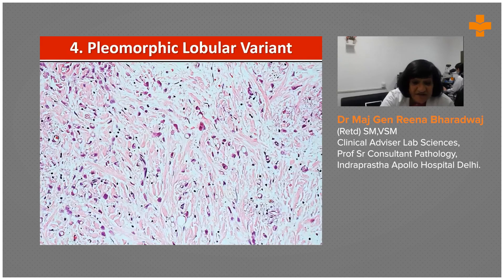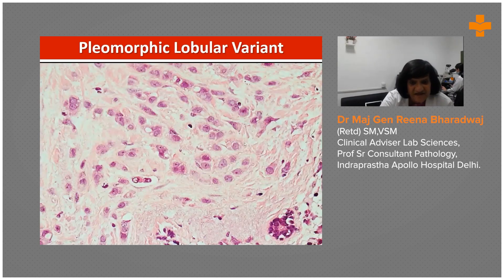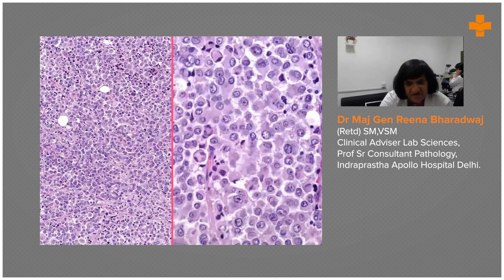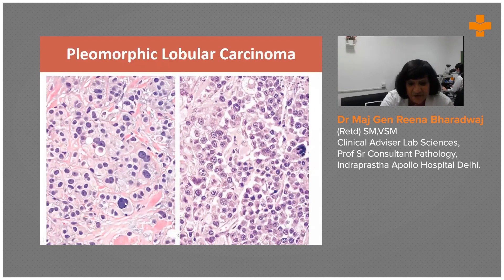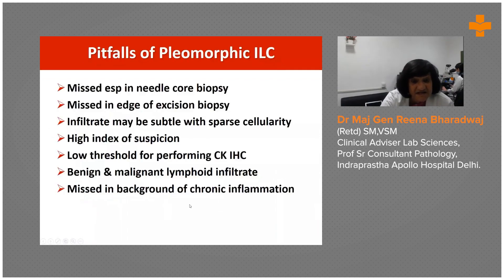The pleomorphic variant shows intracytoplasmic vacuoles, but the cell size is rather large and can look bizarre. At high power, intracytoplasmic vacuoles are present, but some cells have prominent nucleoli and appear quite large — this is pleomorphic invasive lobular carcinoma. Cells can look plasmacytoid, bizarre, with more mitoses than normal. In such cases, look for intracytoplasmic lumina, apocrine differentiation, and foci of LCIS. This variant has an aggressive clinical course and must not be missed on core or excision biopsy.